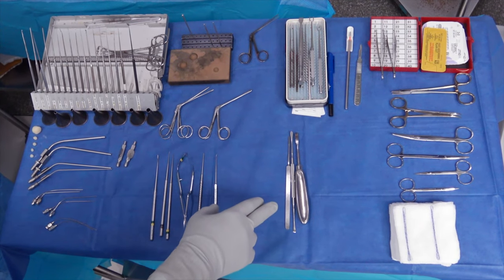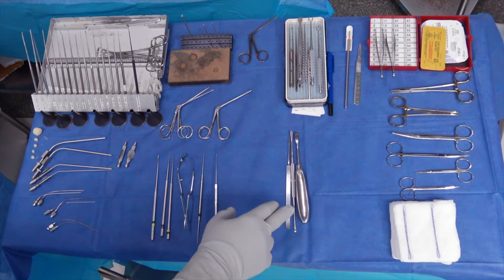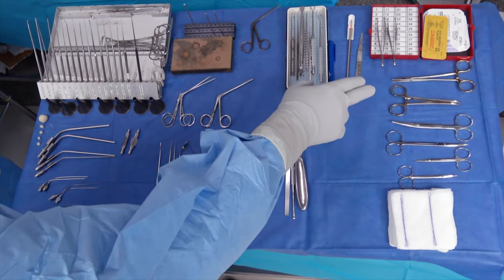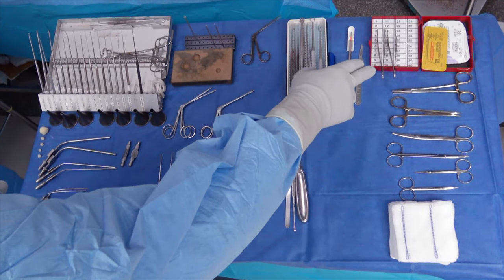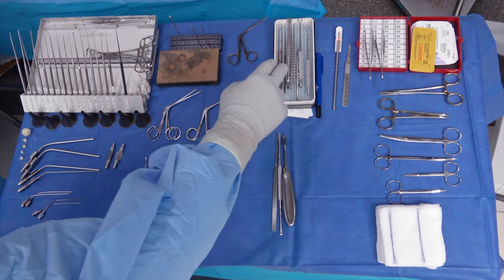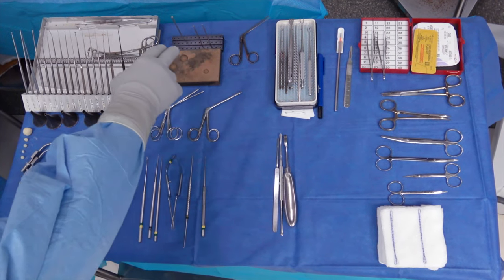These are our subperiosteal elevators, our freer, our big square, our Lempert elevator. And then we have an assortment of scissors here, as well as needle drivers, pickups in Adson and Adson Brown, then we have our 15 blade for incision, double pronged skin hooks and Senn rakes, and then our drills.